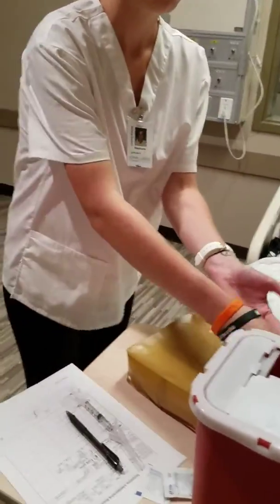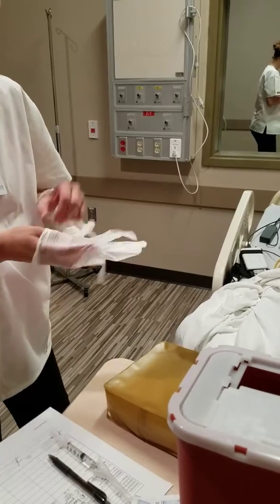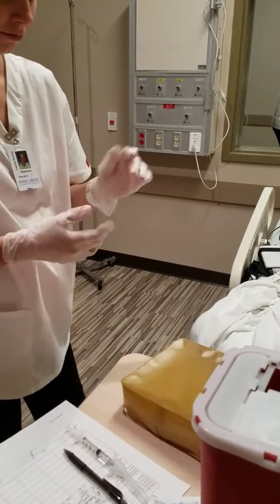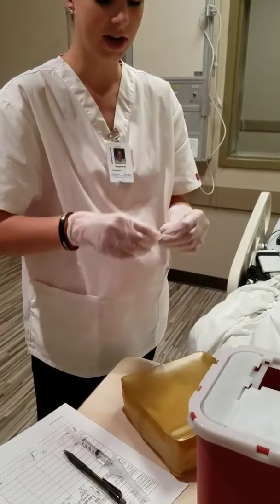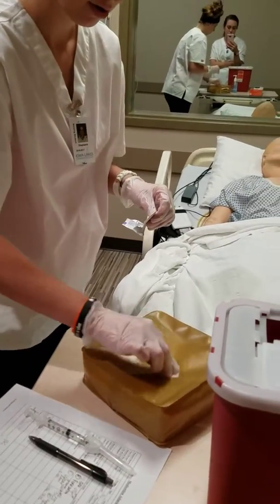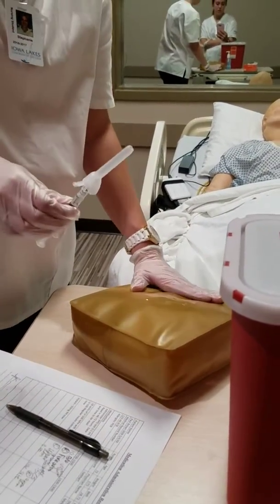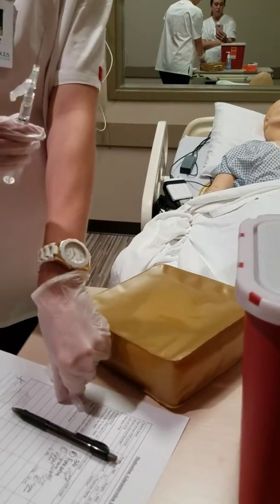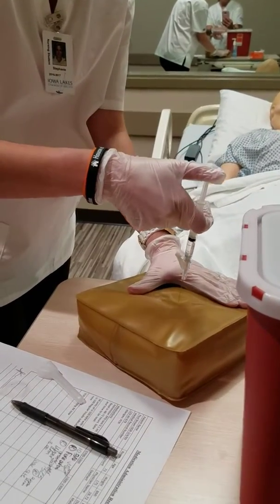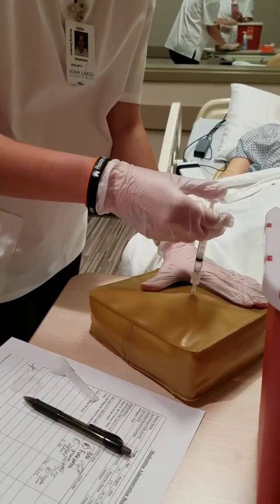The first thing we want to do is go ahead and clean the area. We want to use the Z-track method, which means you kind of pull it back as you inject it. We're going to pull back, go in at a 90-degree angle. Here we go, Mr. Brown. First aspirate — make sure you didn't hit a blood vessel or get any blood in there.